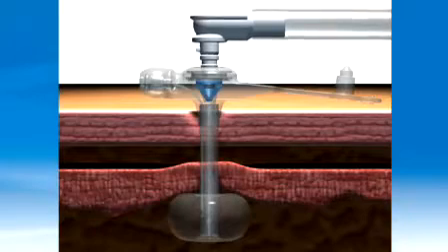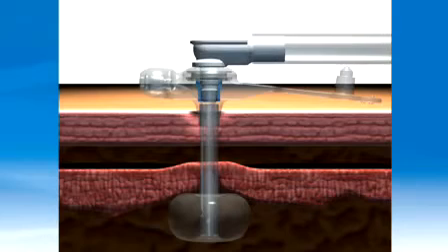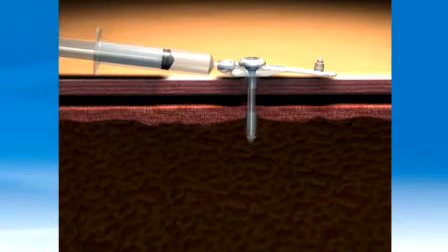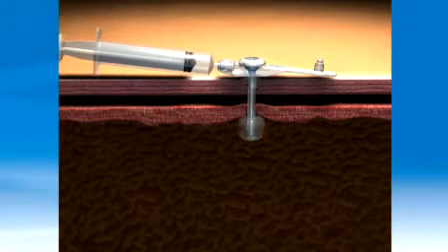The MiniONE Balloon Button has a glow-in-the-dark feeding port, which is used for administering food and medication directly into your stomach. A special anti-reflux valve in the button is opened when a feed set is pushed into the feeding port. This port can also be used for decompression, which is the venting or releasing of gas or liquid from the stomach. The button is held in place in the stomach by a balloon inflated with distilled water.